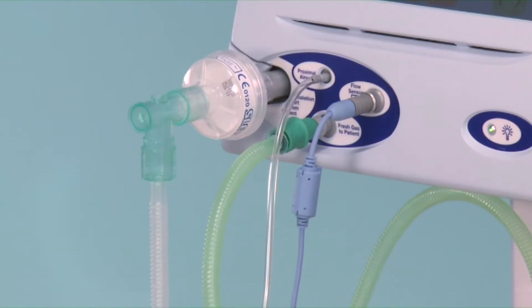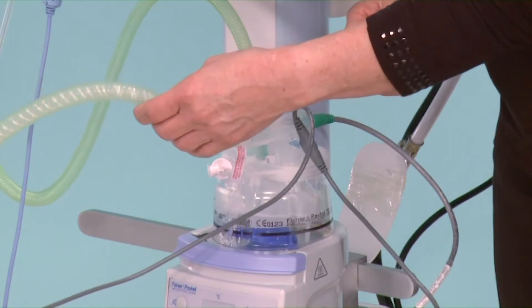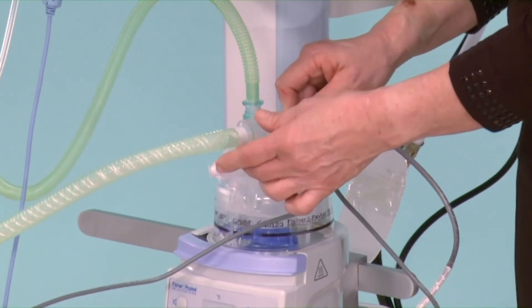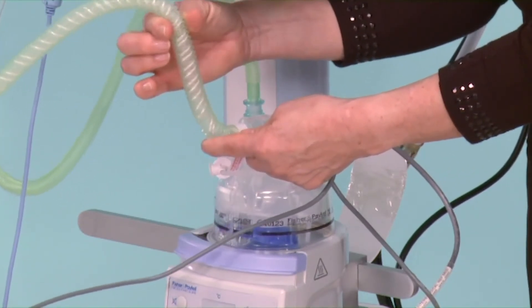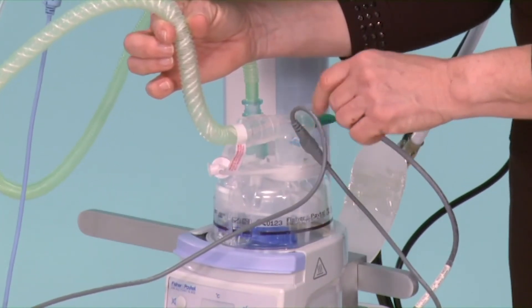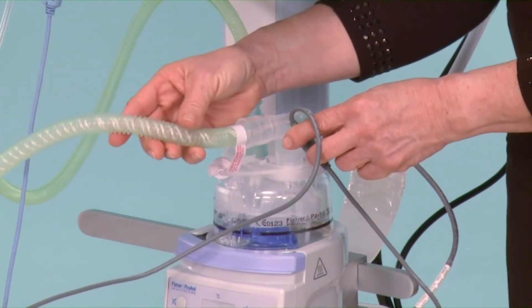Should water collect in the inspiratory limb, you need to prevent it from getting all the way up to the flow sensor. Because this is a straight connector, this makes it difficult to run water back into the chamber. One tip is to gather as much of the water as possible to this point, then very quickly slightly loosen the temperature probe and reconnect it. In this way, the vacuum in the inspiratory limb is broken and the water will run back into the chamber.